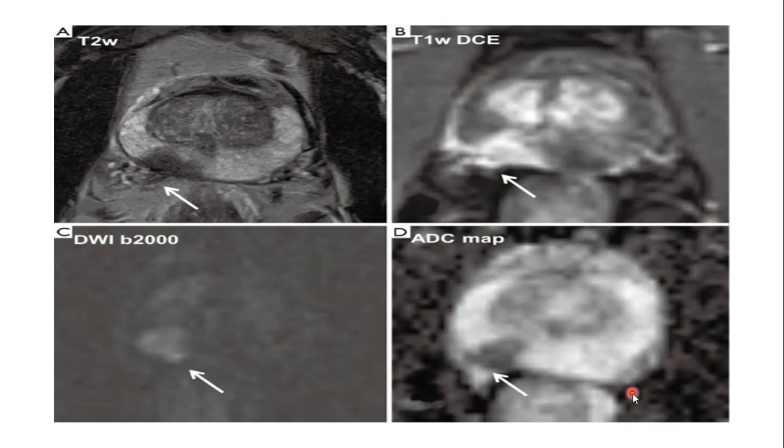You have discussed FDG PET-CT, but there is a role of PSMA PET-CT. And PSMA PET-CT is now evolving also in non-metastatic CRPC. So we know the indication of PSMA PET-CT also. Actually, we were talking about something in the primary setting, in the diagnostic workup. I don't know whether PSMA PET-CT is something for primary detection, is it? No, it is not for primary detection. Right. So we were just talking about the diagnostic aspects for the primary disease.